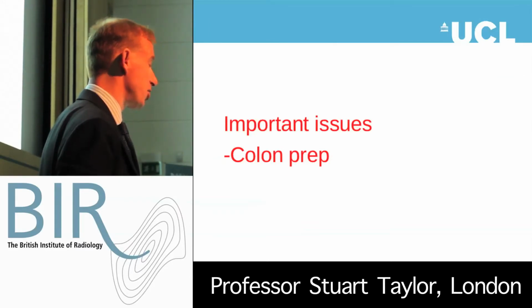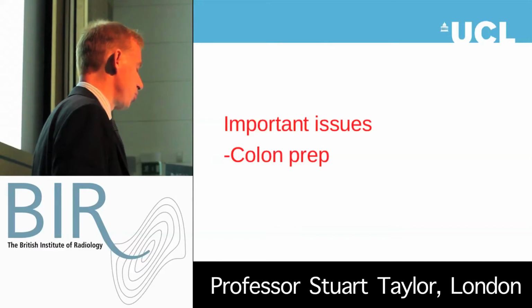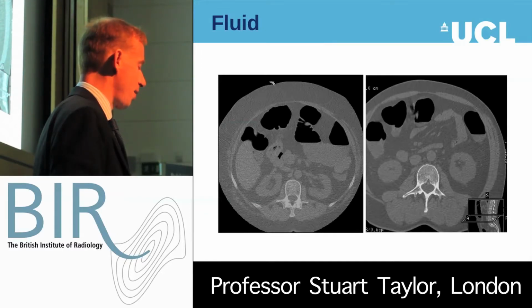So colonic preparation is very important. It's a bit tedious and not particularly glamorous, but if you don't prepare your patients right, then you won't do very well when you come to report them. For example, if you use too much fluid, a very wet prep like the endoscopists use, you can drown the colon out, so you can miss quite large lesions. The endoscopists can suck that fluid out through the scope, but of course we can't do that, and you can really compromise yourself by using the wrong type of bowel prep.